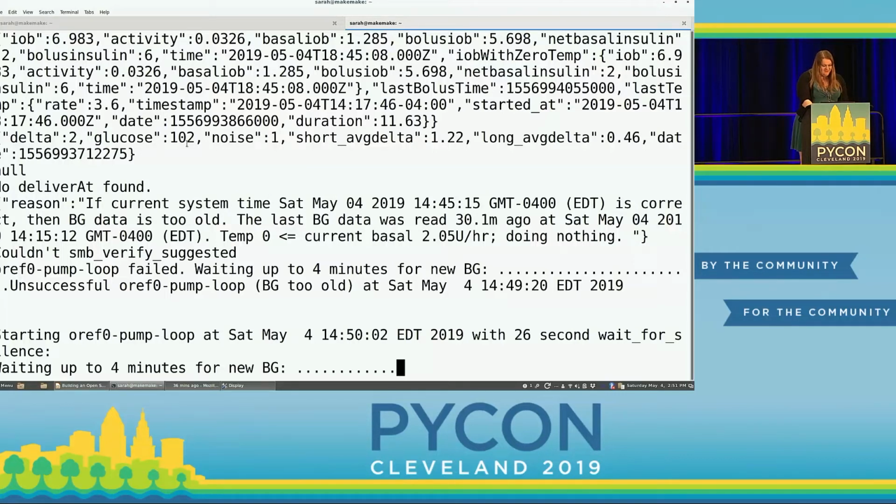But you can see there's a whole bunch of log data up there. So what it does is it listens for some radio interference. If it gets the all clear, it then starts talking to the pump, finds out the latest dosages the pump has given out, syncs that with its own data up in that Heroku instance, the database app, and then sees what my trends are, and then sends a new value that says, hey, insulin pump, for the next 30 minutes, give this much insulin instead. So it's constantly giving all these little minor variations, which in turn ends up in that little graph.